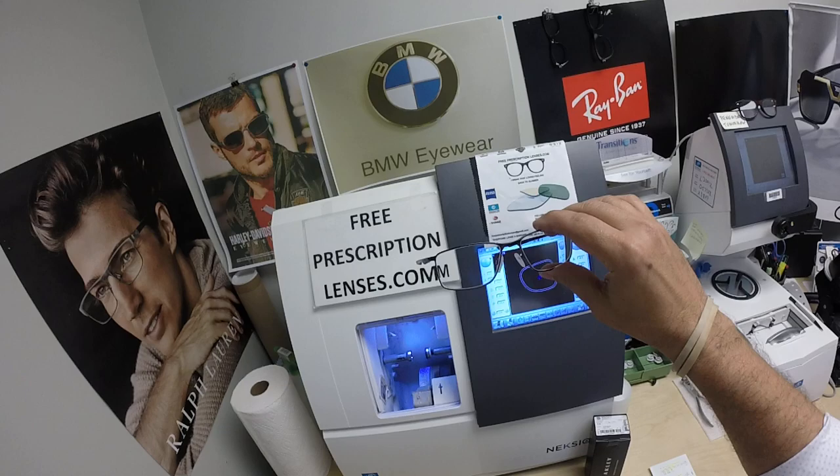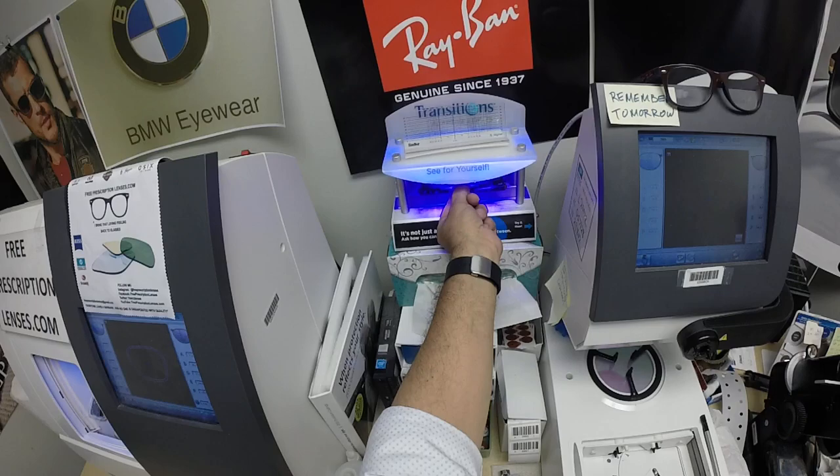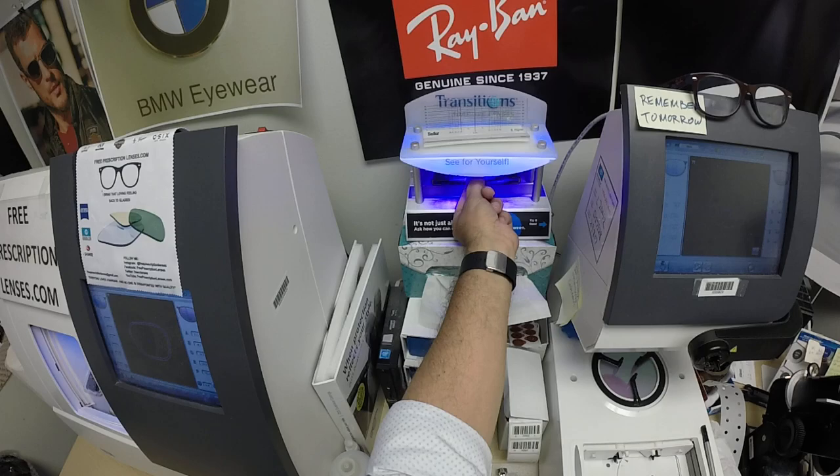This is what they look like clear. Let me go ahead and expose them to a strong burst of ultraviolet light, and as you can see it'll take about 30 to 45 seconds for the lenses to darken — a little bit longer when you come back inside, 45 seconds to a minute, maybe a minute 15.